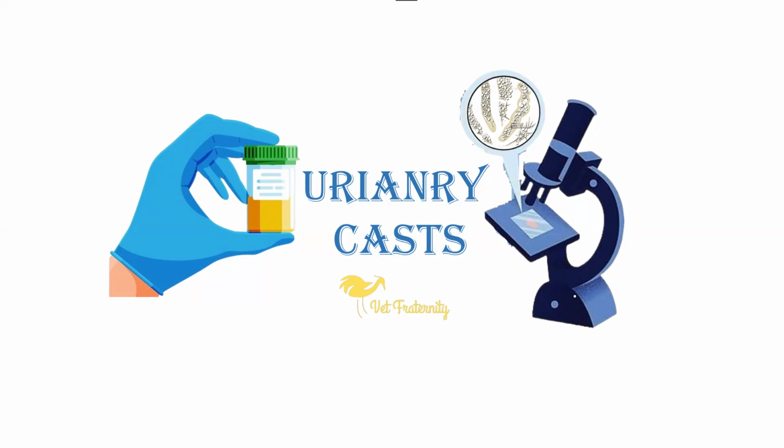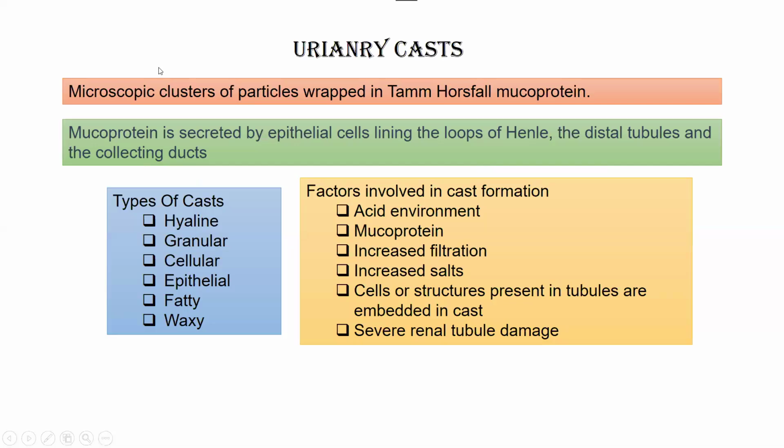So, let's begin. The definition of cast is that these are microscopic clusters of particles that are wrapped in a Tamm-Horsfall mucoprotein. So, these are basically microscopic clusters of either cells or cell-like structures, fat, or any other thing that will appear in the urine, and they get wrapped or entrapped in this protein called Tamm-Horsfall protein, and they form the casts.